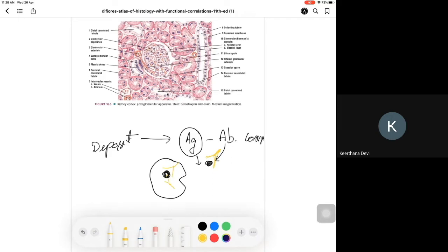And in that itself, you have to know again, there are four things in the kidney. What are the things we use for diagnosis of renal disease? One is light microscopy. Two is histochemistry, like what I told, PASD, trichrome, Gomori's methenamine silver stain.